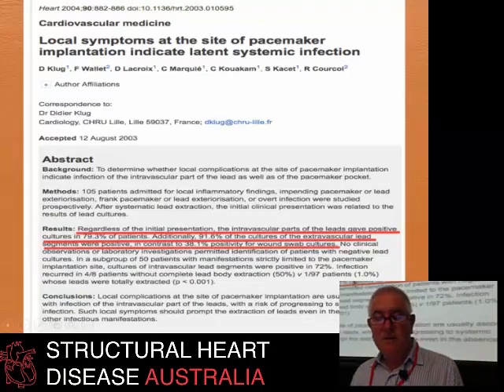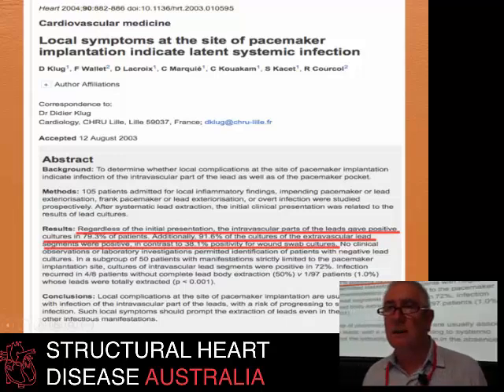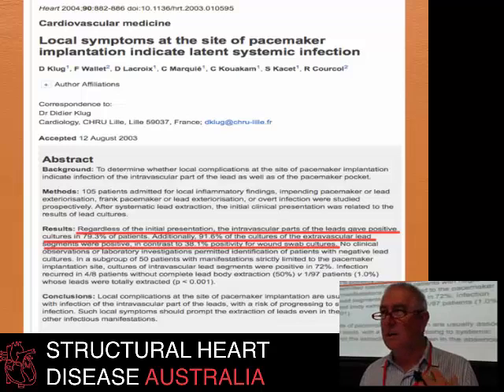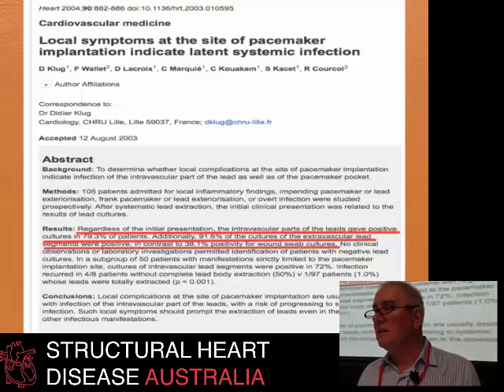Additionally, 90% of the cultures of the leads in the pocket, so the extravascular leads, were also positive, yet a wound swab in the pocket done at the time of surgery was only positive in 40% of cases. So basically what that says is that if you've got a pocket that looked infected, it's very likely that everything's infected. The idea that used to be propagated years ago that you just locally excise it, wash it out and stick it beneath the muscle is probably not good enough.